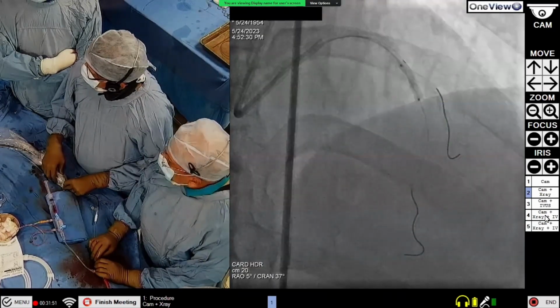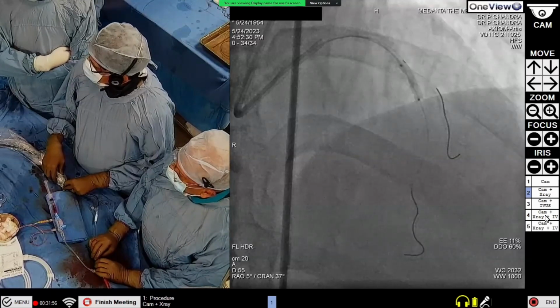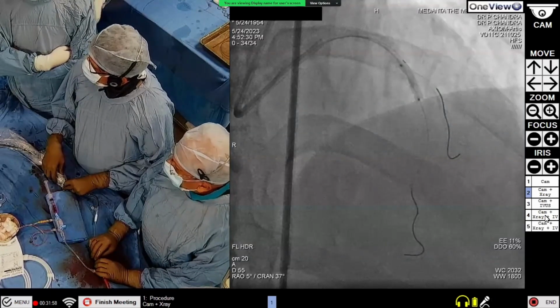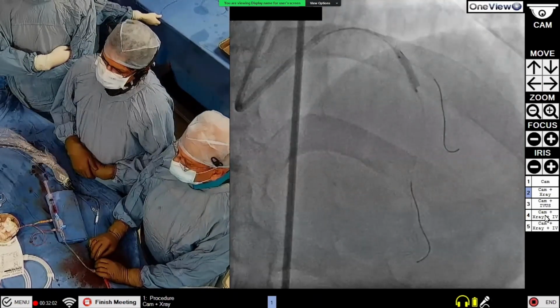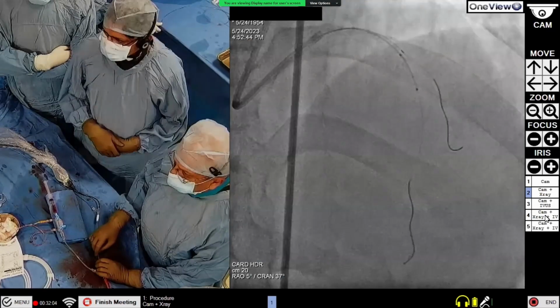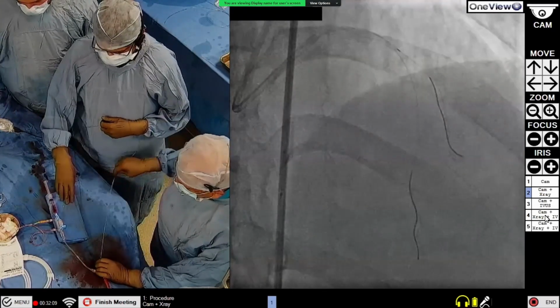So this is the last couple of pulses. 9, 8, 7, 6, 5, 4, 3, 2, 1, 0. Okay. Deflate. So we are done, and now all the pulses are finished. I'm trying to take it out.